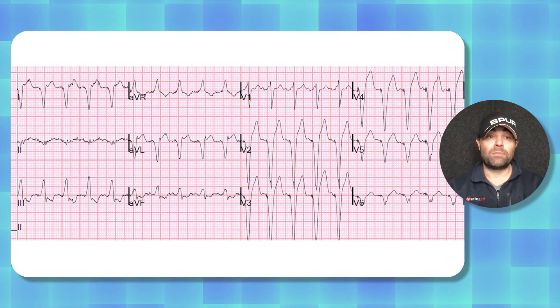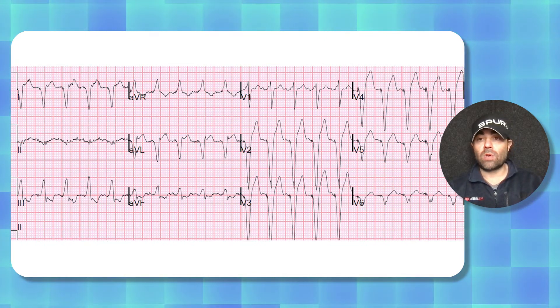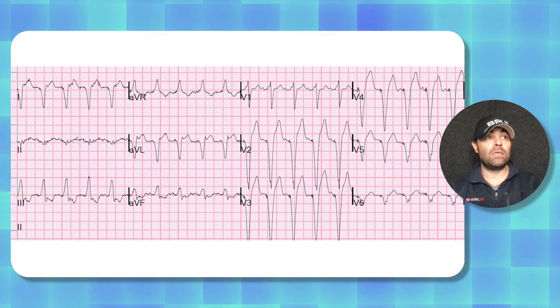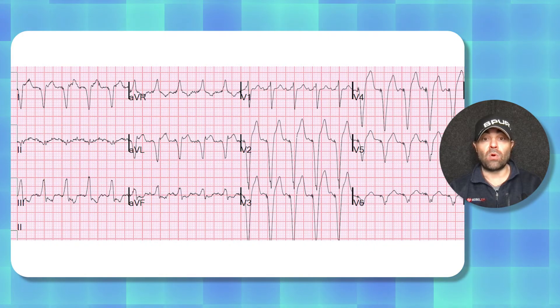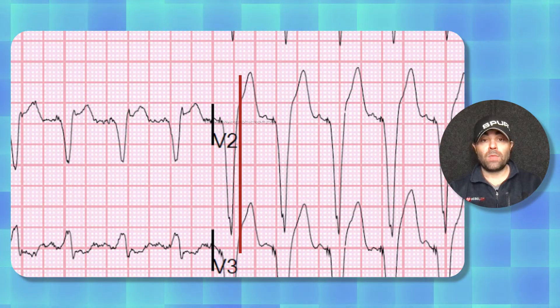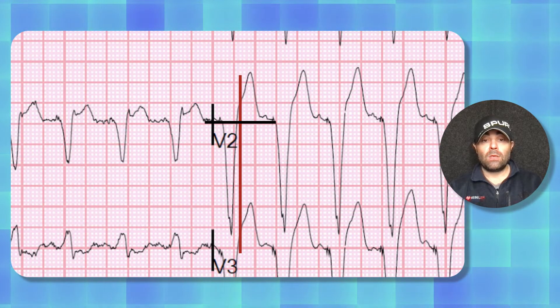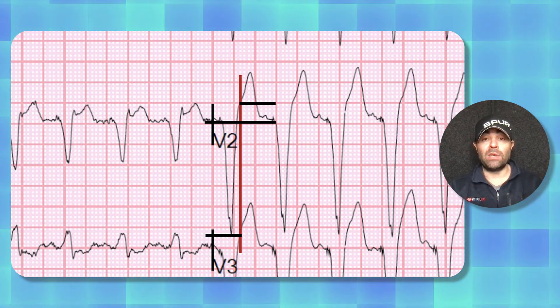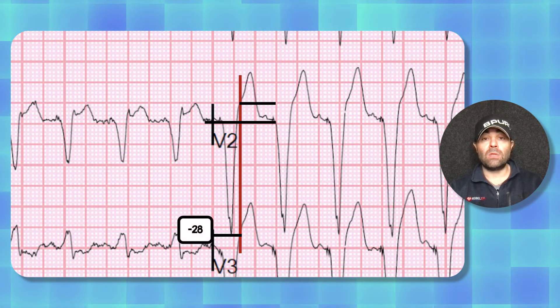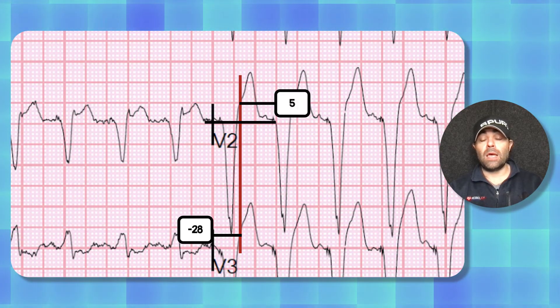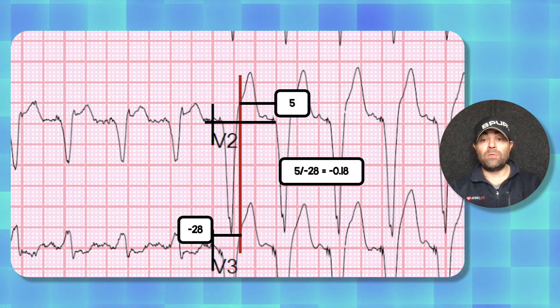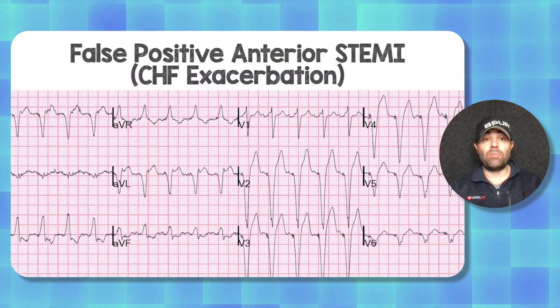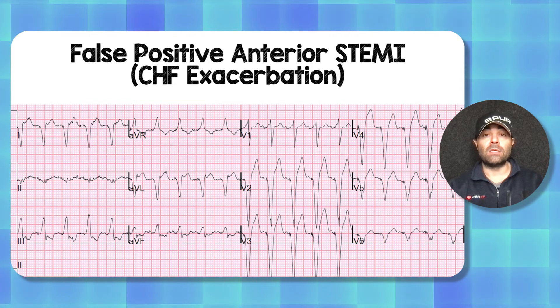Here's another patient presenting with chest pain and shortness of breath. No concordant change could be found on this EKG, so the question becomes: is there discordant change, and does the modified Sgarbossa criteria point to heart alert activation? The red line represents the J point and the black line is the baseline. Counting the little boxes, there are 28 for the amplitude of the QRS and five for the elevation at the J point. Dividing those two gives negative 0.18, which is less than 25% of the QRS amplitude — this ended up being a false positive; the diagnosis was a CHF exacerbation.